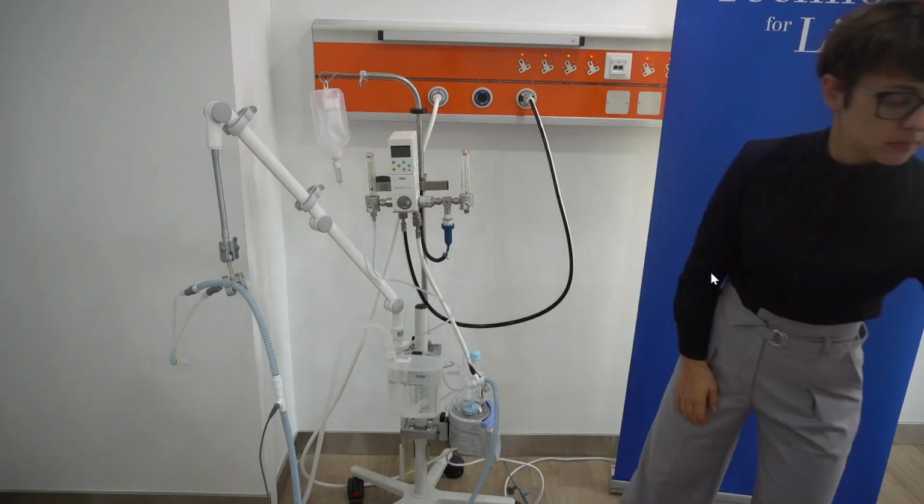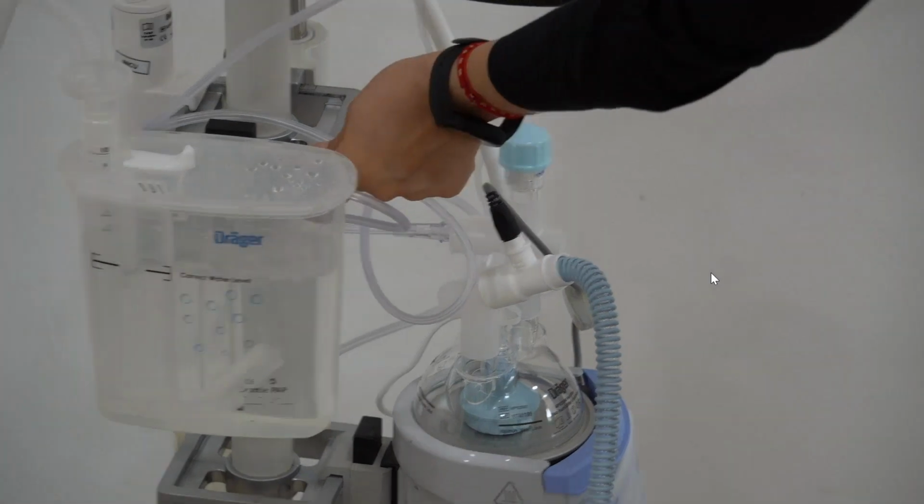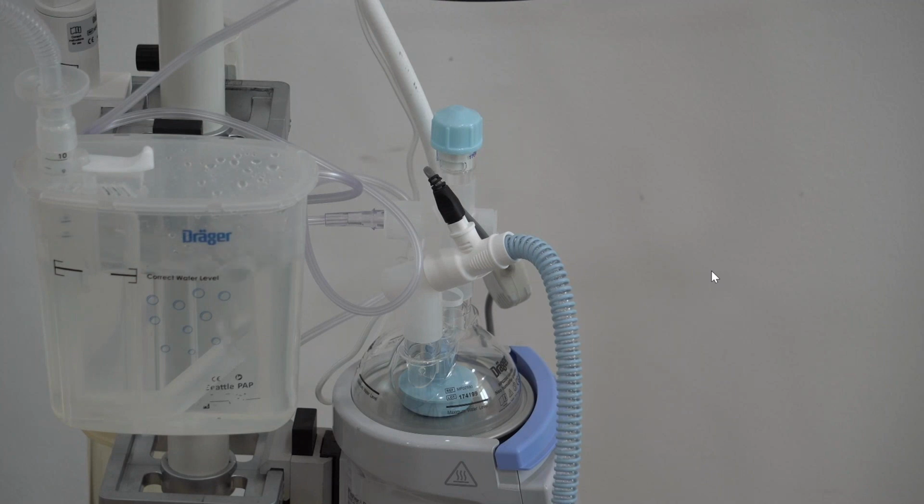The water will need to be filled up. Remember, it's heated, and humidified, so that already prevents problems. But generally, we would change the circuit every 7 to 10 days, because the risk is what is harboring in the circuit. The water is filled up, but you've got to watch the water level because it evaporates.